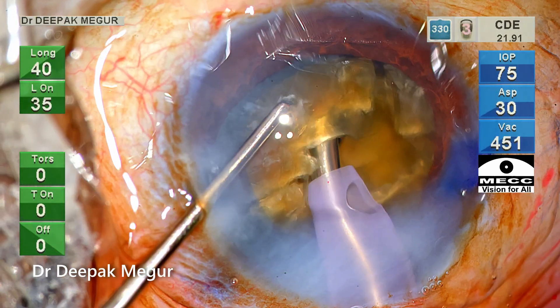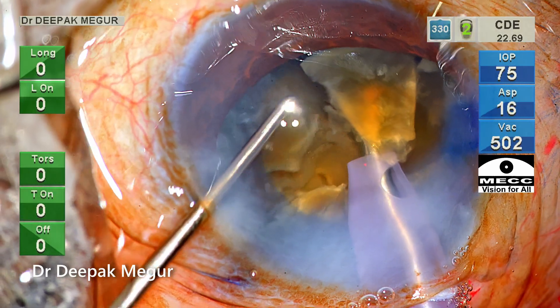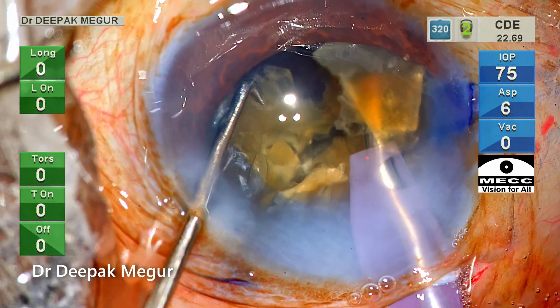This nucleus wasn't quite as hard as some of the previous cases. But again, the secret to achieving a good chop is always to get a good grip in the central core of the nucleus.